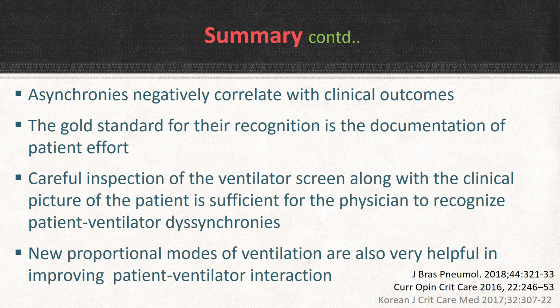The gold standard for their recognition is the documentation of patient effort, and the most important thing is careful inspection of the ventilator screen along with the clinical picture of the patient, which is sufficient for the physician to recognize patient-ventilator desynchrony or asynchrony. New proportional modes of ventilation are also helpful in improving patient-ventilator interaction, but they are not available in all models or all brands of mechanical ventilator.